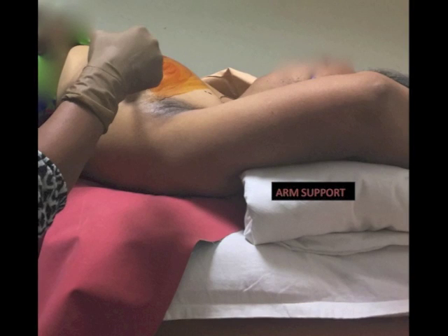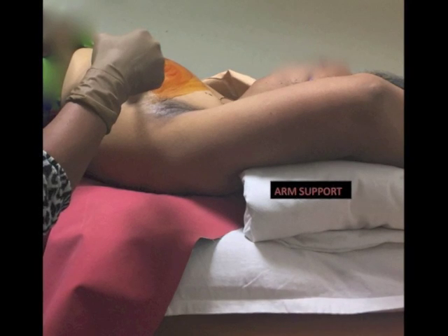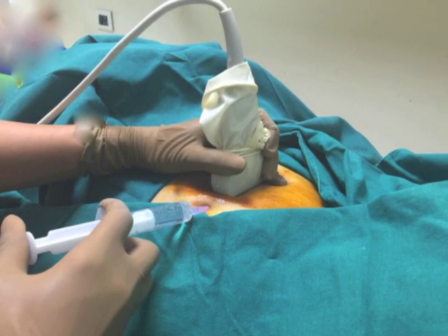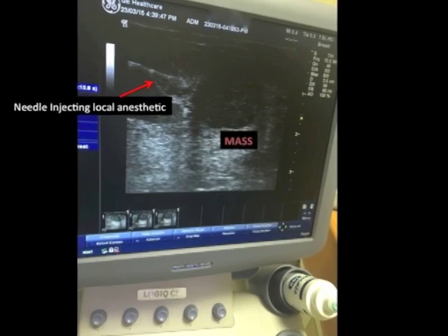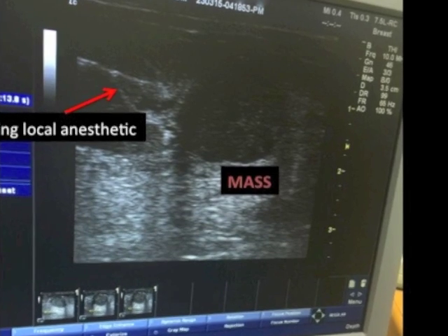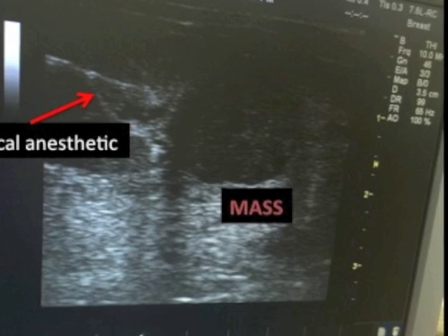The patient is given a comfortable position with the hand raised over the head. A roll is placed under the shoulder to give a tilt as necessary. A sterile prep and drape is then performed. A point of skin entry sufficiently away from the probe is selected and the local anesthetic is infiltrated into the skin, biopsy tract, and around the lesion. A spinal needle is used to inject the anesthetic beyond the lesion. You can see the anesthetic being infiltrated all around the lesion so that the patient feels no pain during the biopsy.